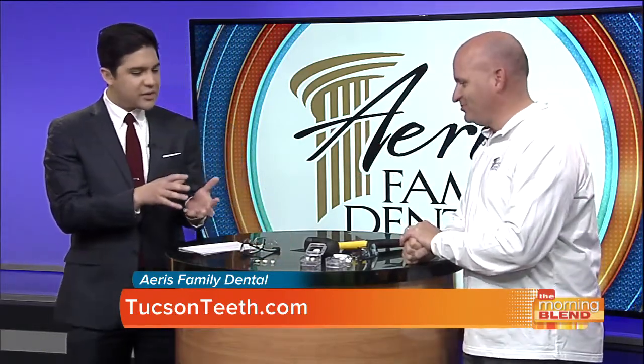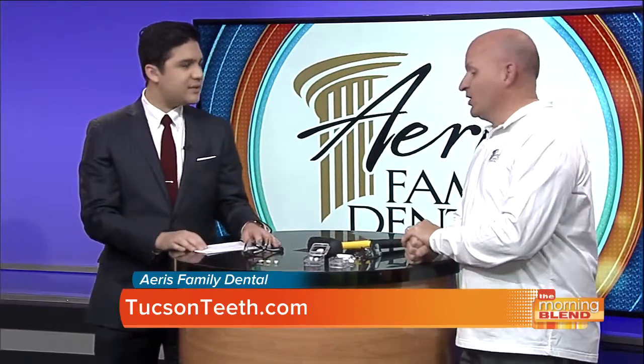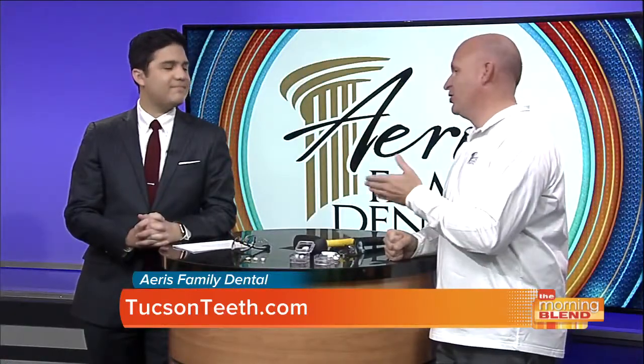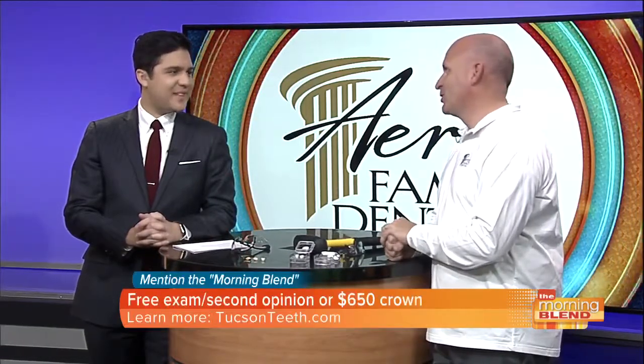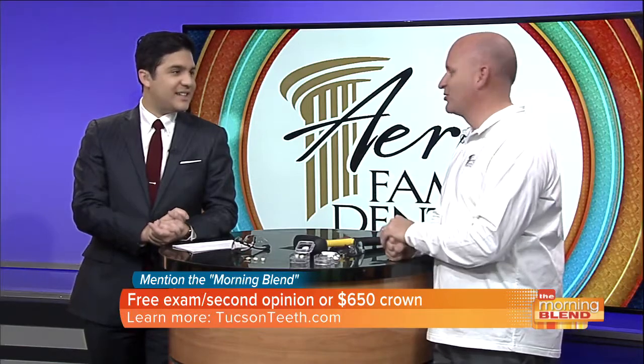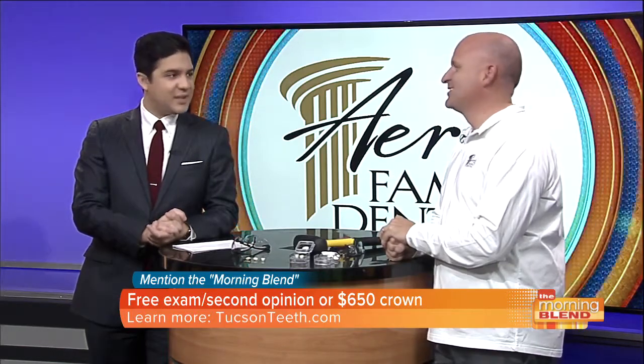So if this material is so strong, why would it ever have to be replaced? So we don't anticipate the crown to fail, as you can see. Yeah. It really holds up. What can fail is the tooth that's underneath. Yeah. And so someone that doesn't take care of their teeth, doesn't floss, doesn't brush, has some other issues like that, or even some medical issues that can contribute to dry mouth and cause cavities, their teeth can fail. But as you can see, the crowns typically are not. Crown's pretty much set for life, right? I mean, you don't ever really have to do anything. As long as the tooth is good, the crown should do well. So take care of your teeth is what the doctor's saying.